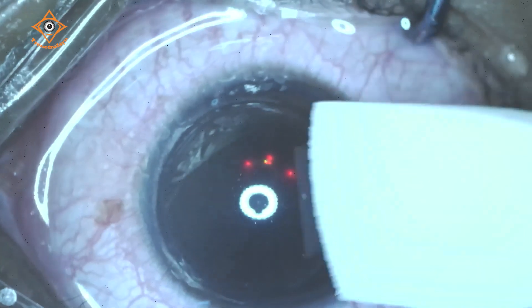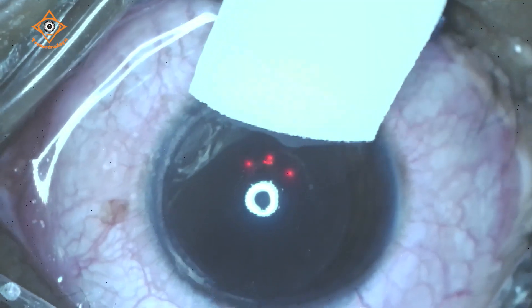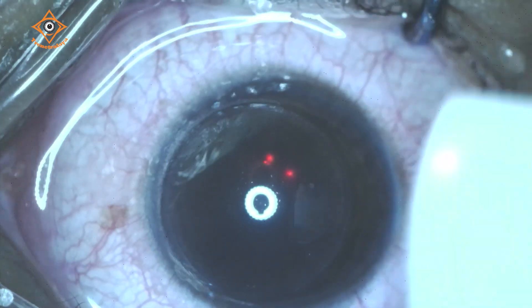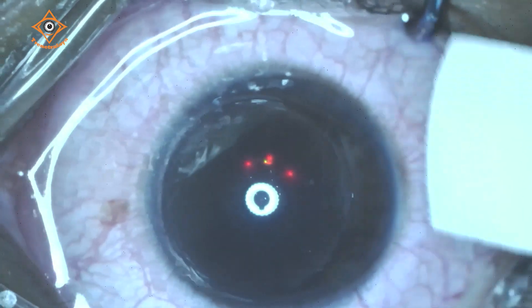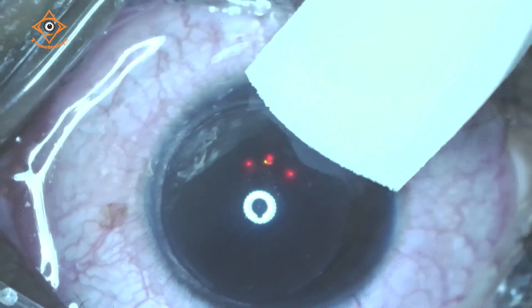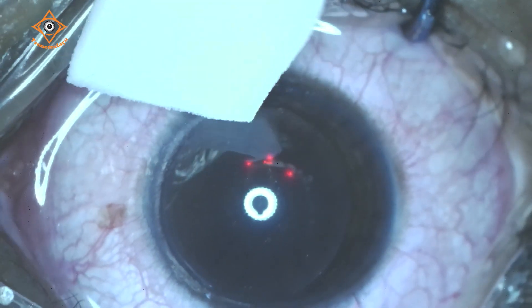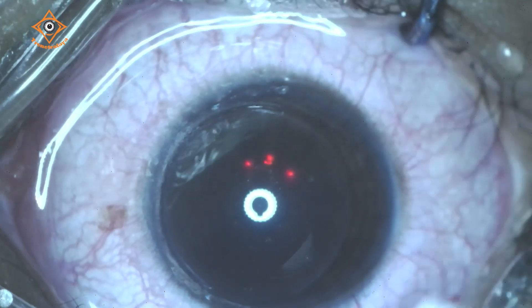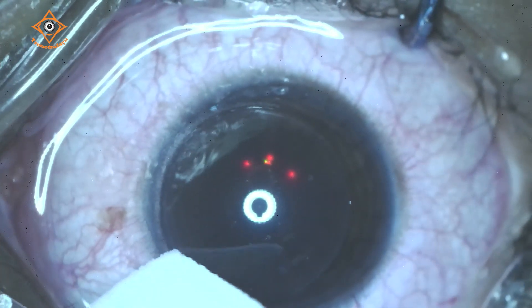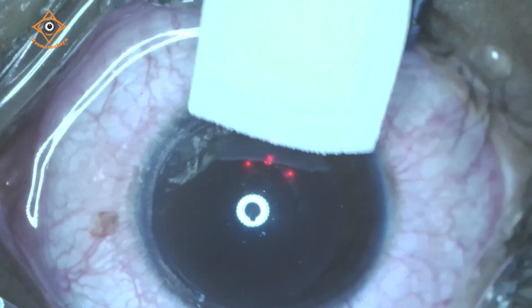We are almost through with the first eye and will now take up the second. Another feature of the MEL90 worth highlighting is its dual frequency delivery system — you can operate on either 250 Hz or 500 Hz. Most cases are done at 500 Hz, but for PRK at higher diopters of correction, 250 Hz is recommended. That is one advantage of this machine having dual frequency.